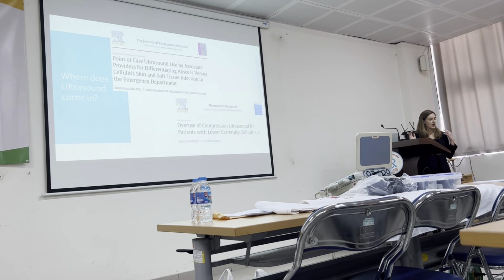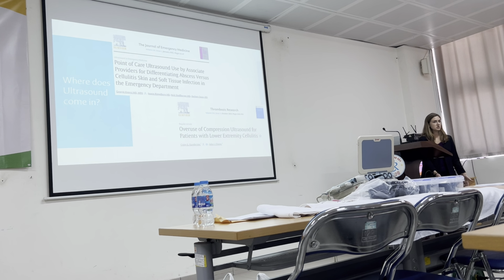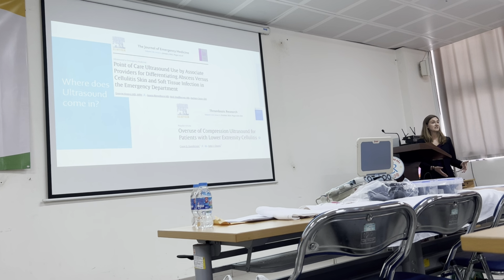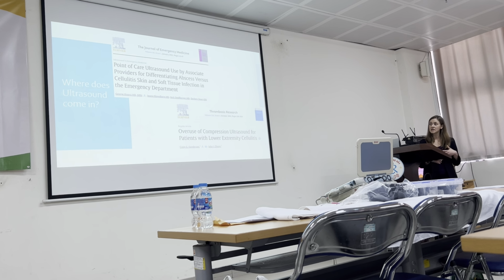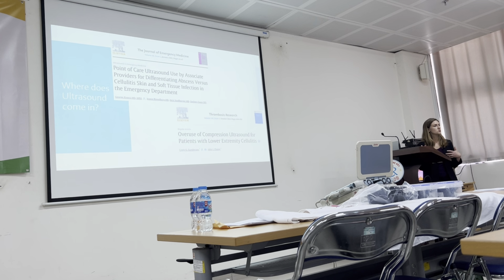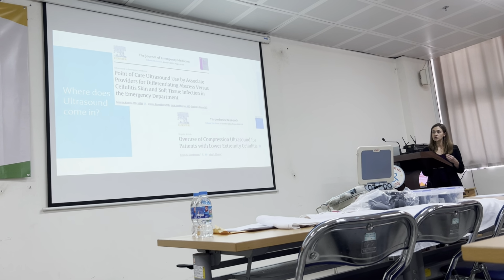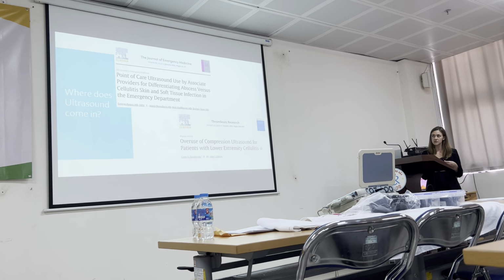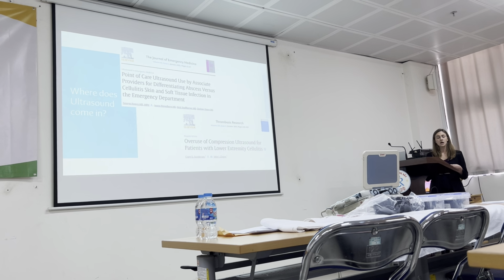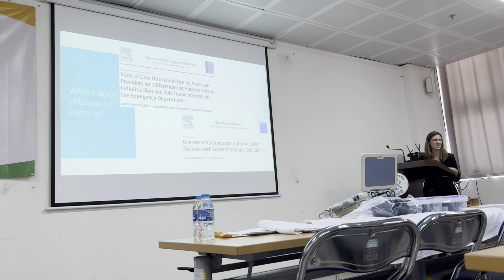So in a patient that has just one side, one extremity that's swollen, especially in the leg, and we think it is clinically cellulitis, in the United States, at least, there is the tendency to overuse ultrasound to rule out DVT. But you have to use your clinical judgment for both of these, come up with your differential, and let that guide your use of ultrasound and not the other way around.